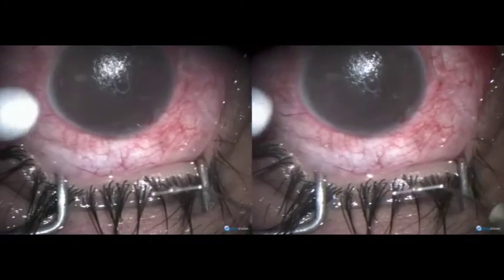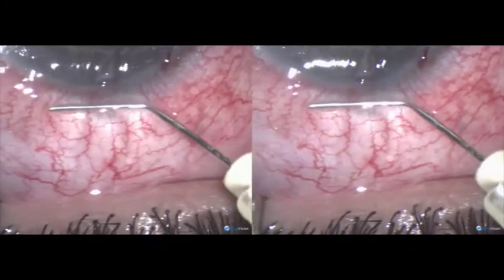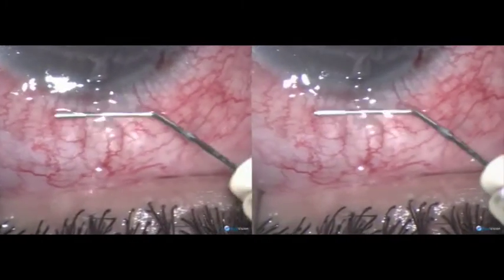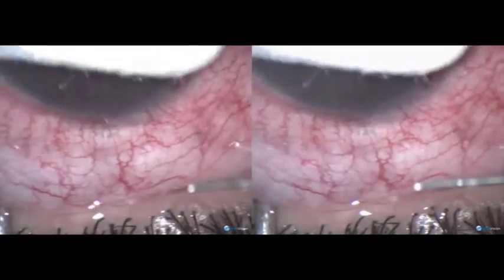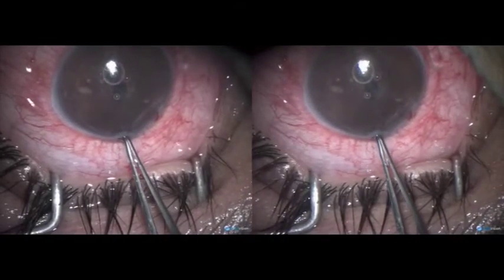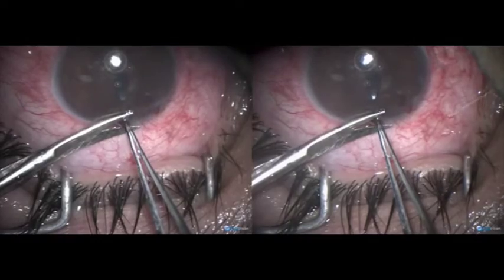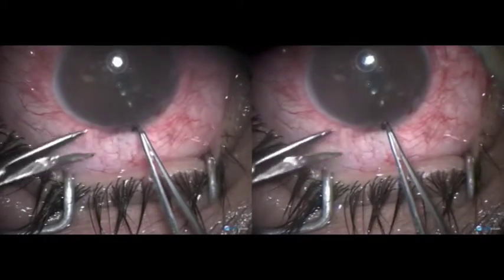When the chamber is sufficiently shallow, you can try introducing iris forceps through the one millimeter incision. A smaller incision is good for quick healing of the incision line. We have been able to hold the iris and do an iridectomy through the one millimeter incision.